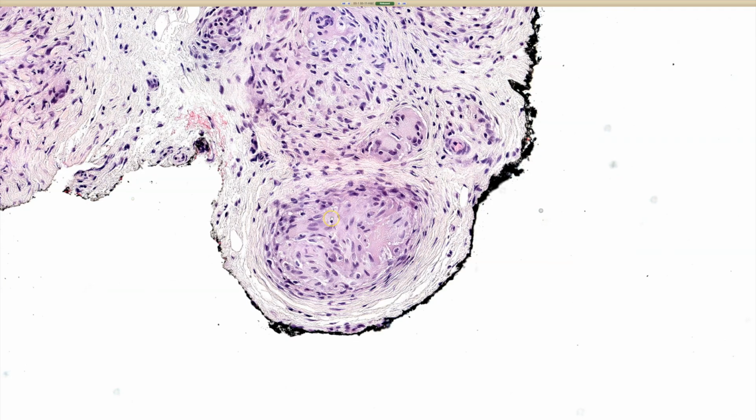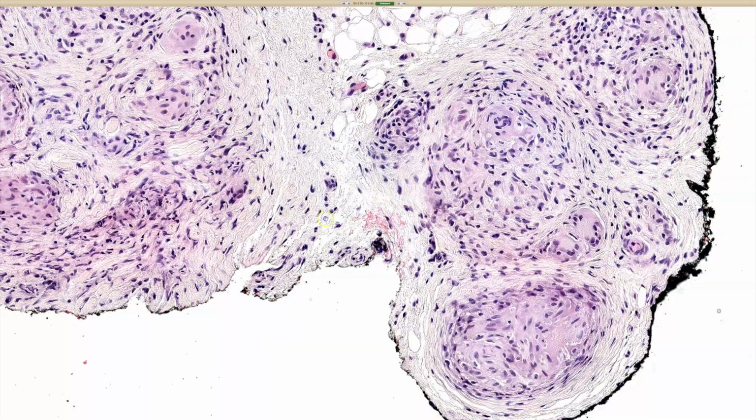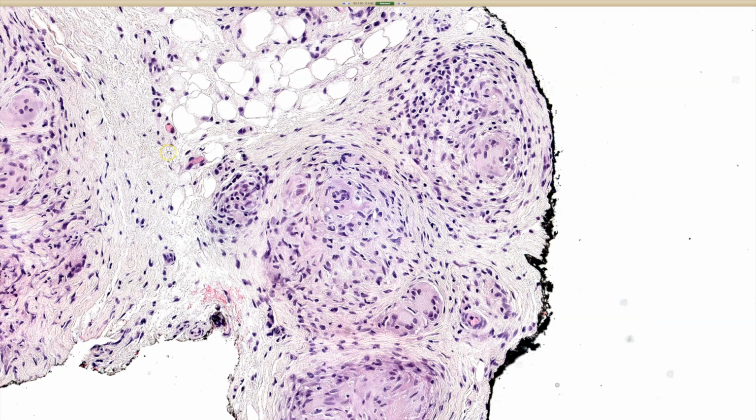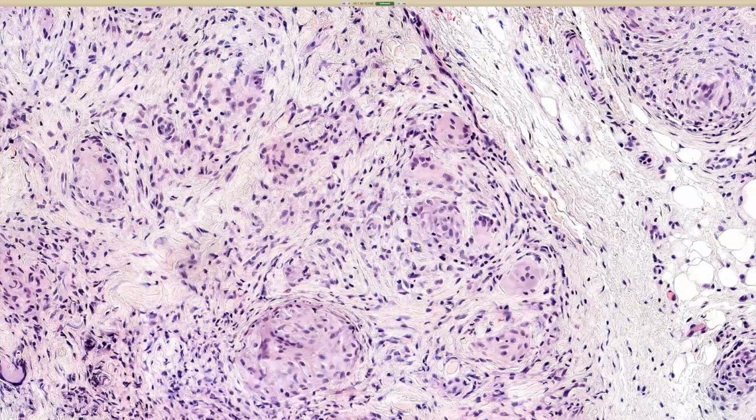This is like a prototypical example of a non-necrotizing granuloma. Usually they do not have necrosis. Every once in a while you can see a tiny bit. But usually non-necrotizing, naked, meaning lacking the inflammation, like you said, granulomas. That's a classic pattern for sarcoidosis.